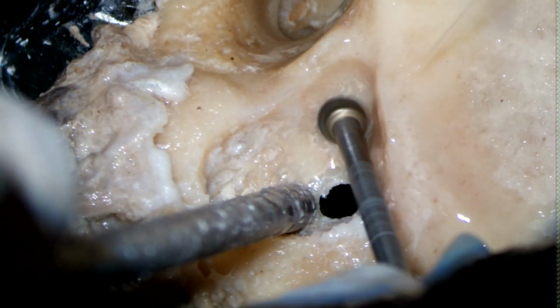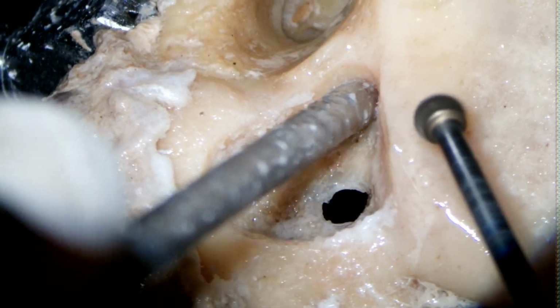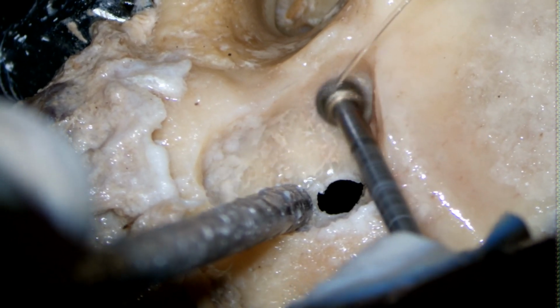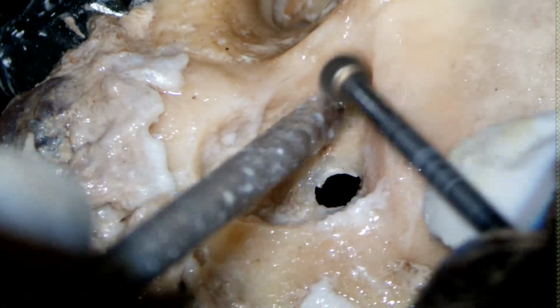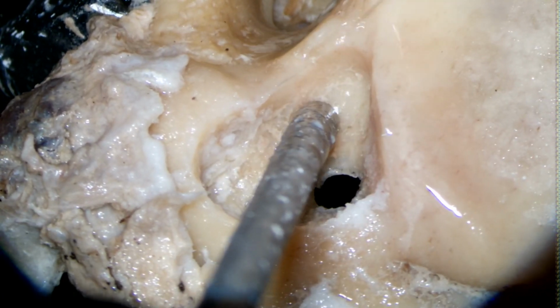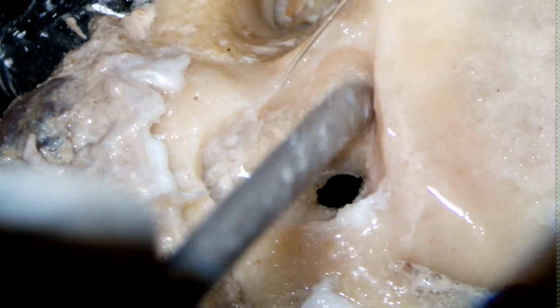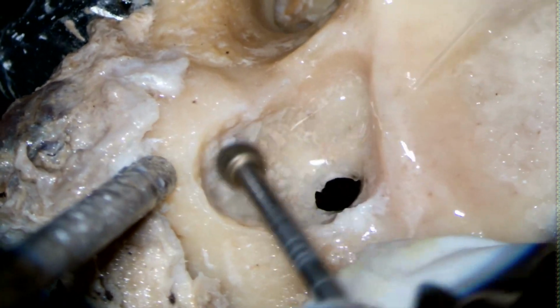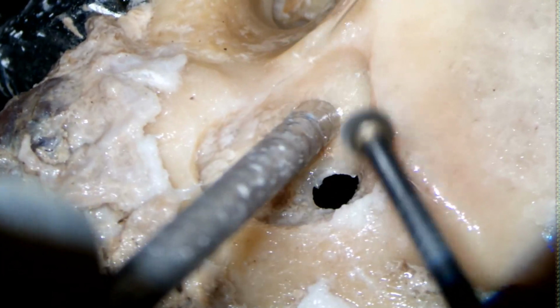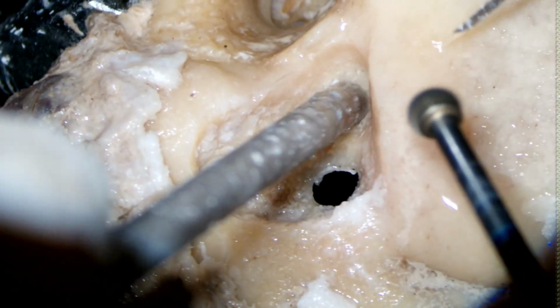So if you have any questions, please ask. So I can see one cell which is coming here, right? Okay, there are few cells here which are coming in view.